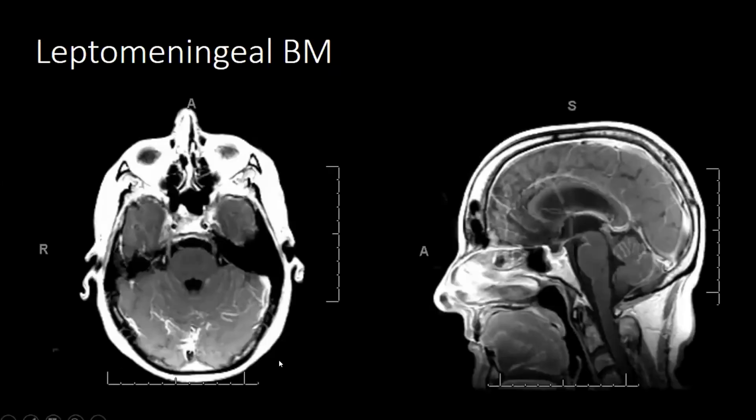The next case is a little bit more subtle because here, this is an FSE case, but this is not a 3D, it is 2D, and you can see you have vessels and they can confound detection of these areas which are leptomeningeal disease. One of the ways to know that is these follow the morphology or the direction of the folia. In addition, one must pay attention to the thickness of the nerves. Here is a trigeminal nerve, and you may not think that there is terribly lot of enhancement, but there is a bit of undulation and nodularity and enhancement asymmetrically more on the right than on the left.